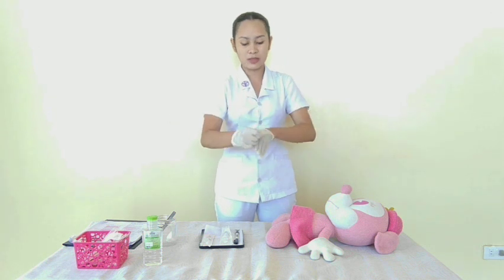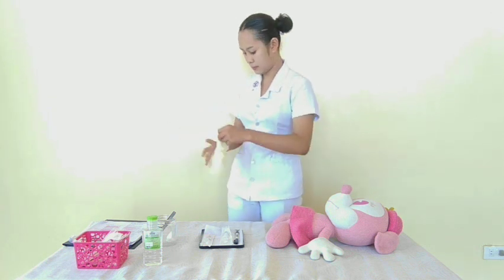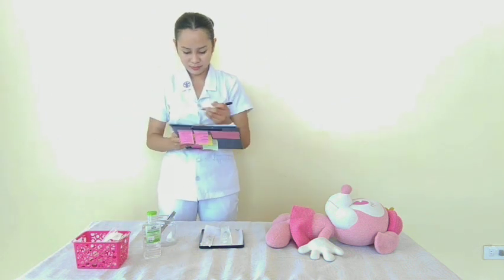So after doing the procedure, discard the gloves, perform the aftercare of the equipment, and perform hand hygiene. Now document the procedure done. And the next procedure is intramuscular injection.